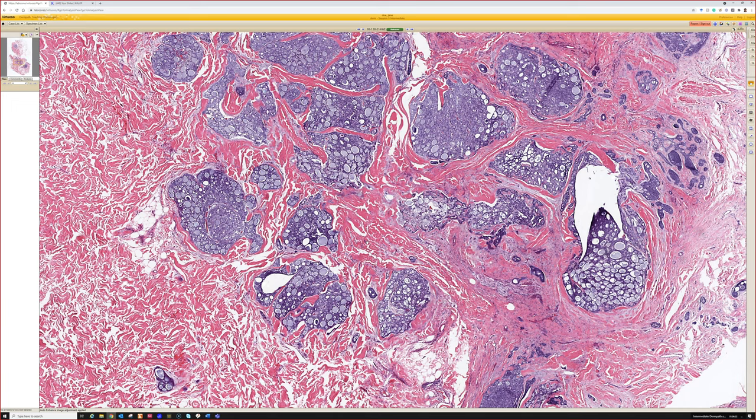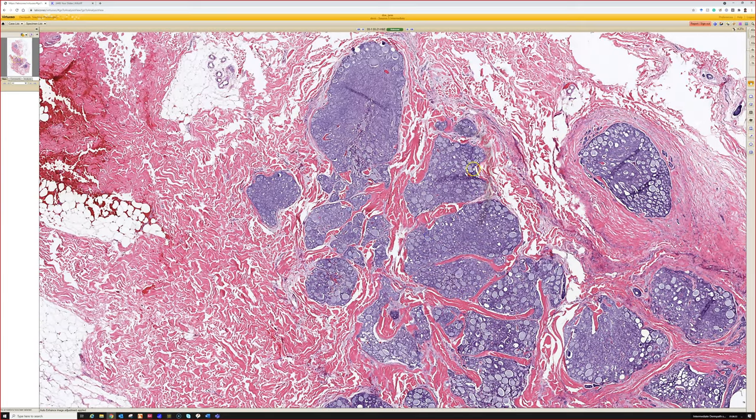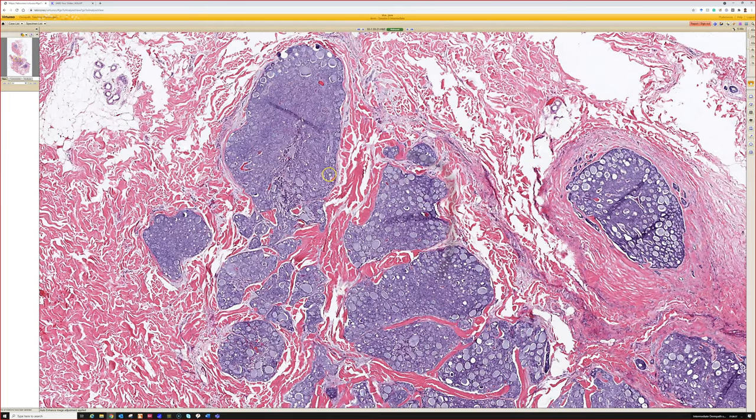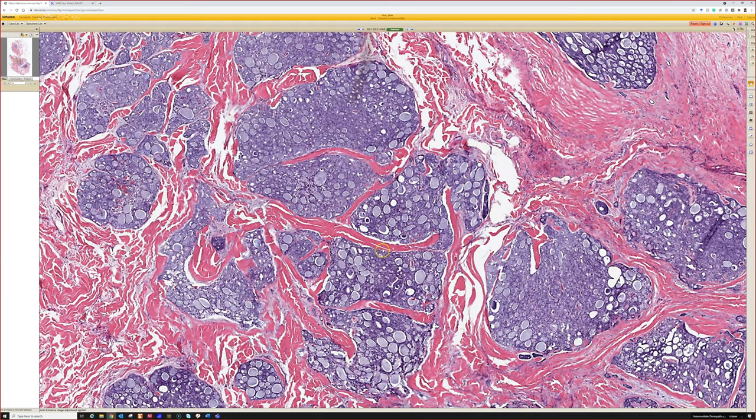But if you've excluded that, we do know that primary cutaneous examples exist. I've published a case report on this a long time ago. I'm still waiting for the Nobel committee to call me about that. But in any case, I will put a link to that down below if you're really curious to read it. But this is what we see as blue basaloid cells.